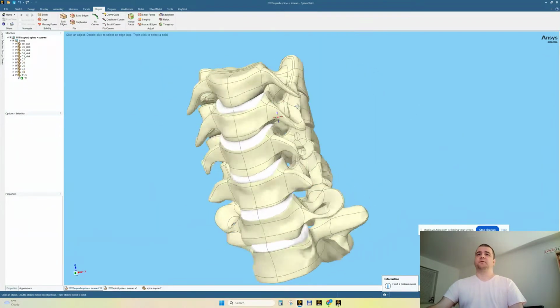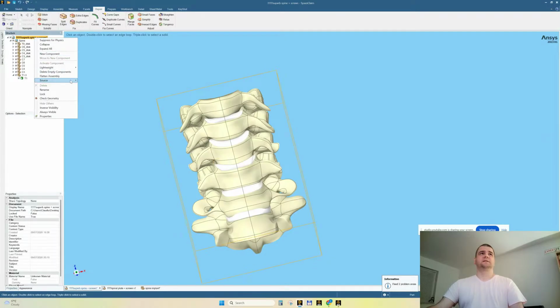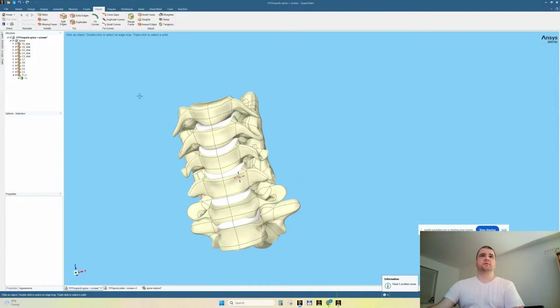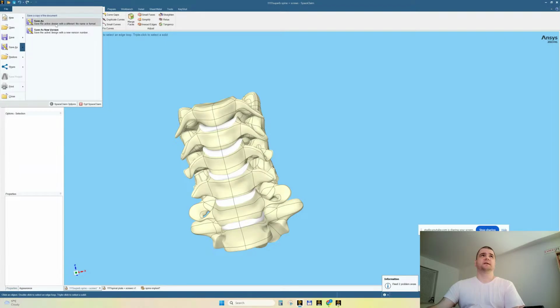Yes, because we are going to move to the implant side. Let's say. So at this moment, let's right-click source, internalize all, because we do not want to have a dependency with a previous 3D model, with the previous file, the originating file. And let's give it another name.